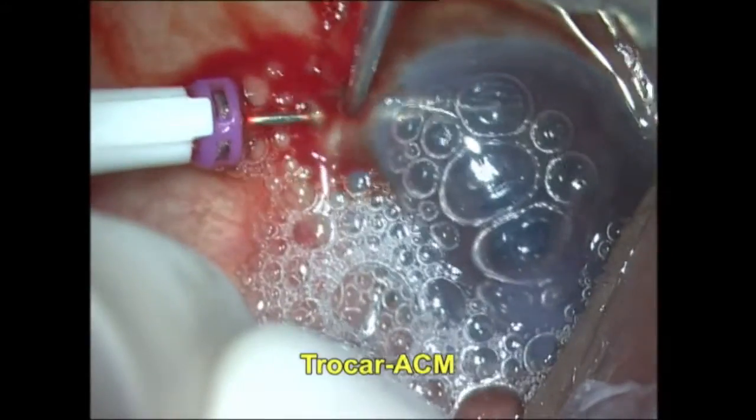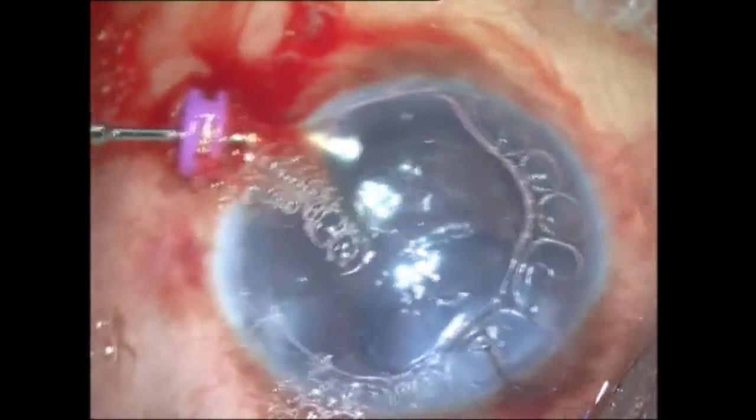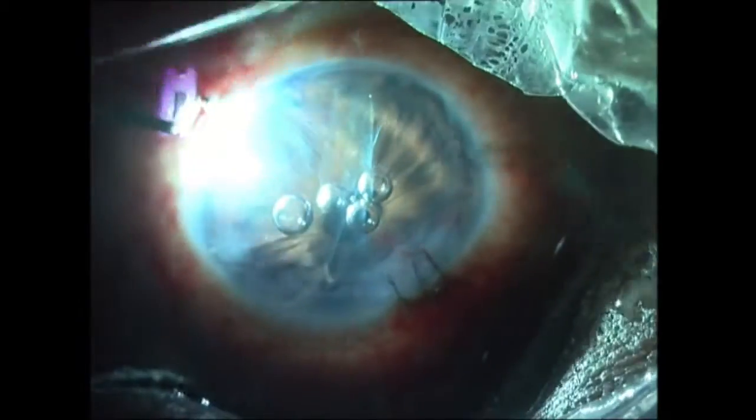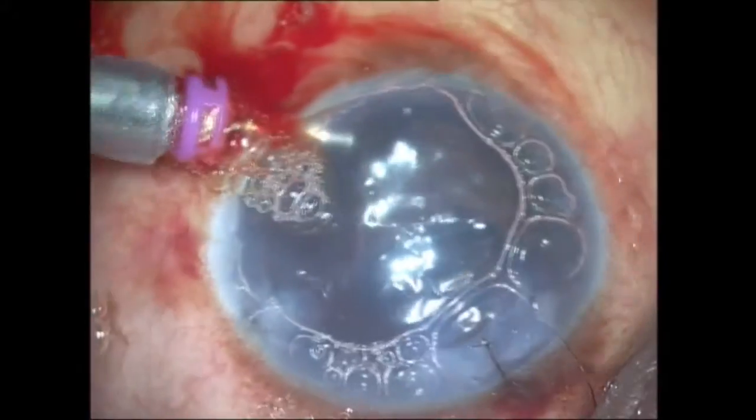Now this is a trocar anterior chamber maintainer. This is one of the ways you can do it, and this was started by Dr. Amar Agarwal. But the other way to do it, if you don't have the trocar anterior chamber maintainer, is just to use a simple anterior chamber maintainer. You just make a paracentesis and use it.